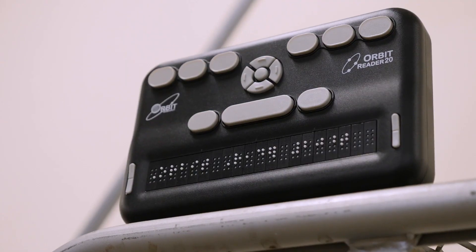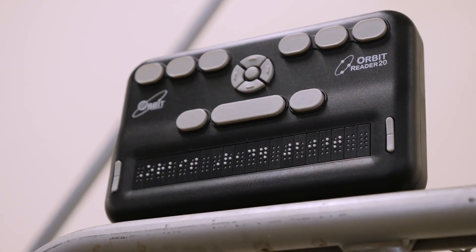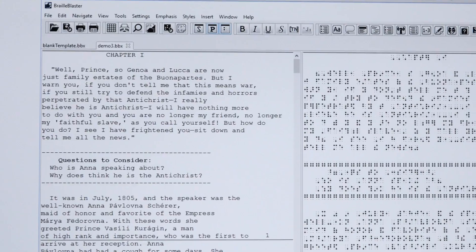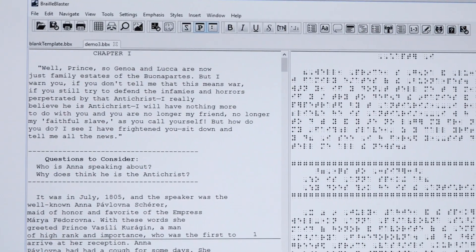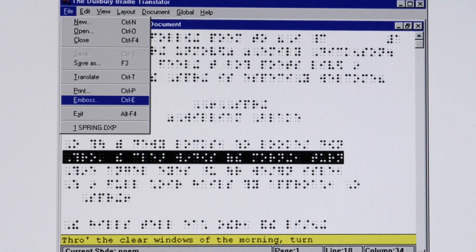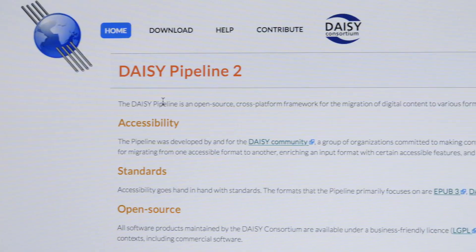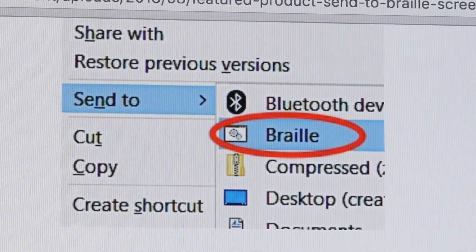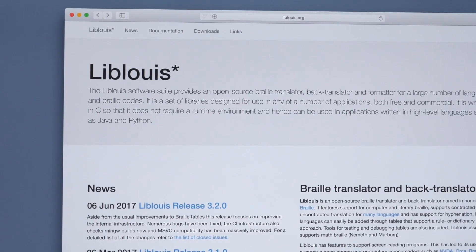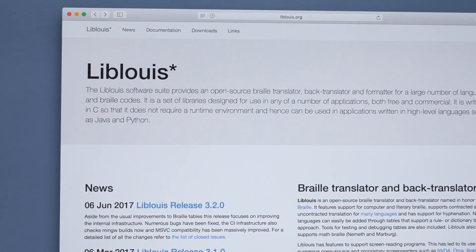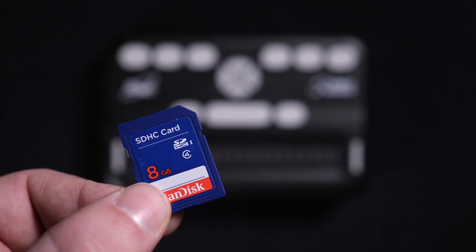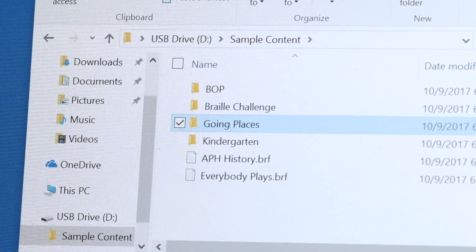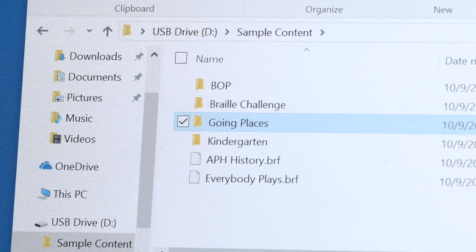For braille translation, there are several tools available, such as Braille Blaster, Duxbury, Daisy Pipeline, Send to Braille, or LibLouis. Your SD card comes preloaded with sample content, and there's plenty of room on it for more.